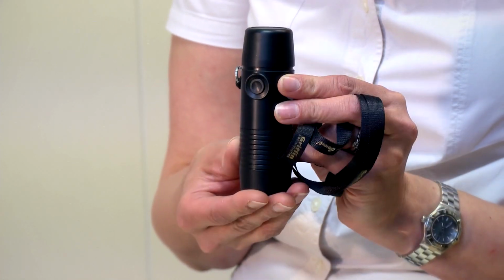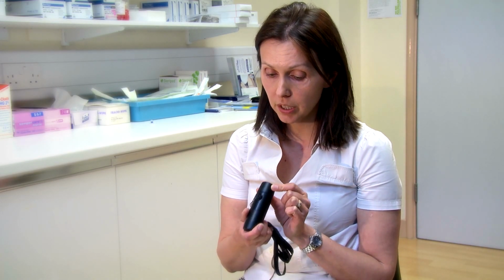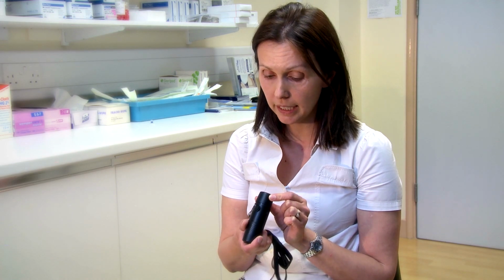This is another option that laryngectomy patients can use. It's an artificial larynx, and it's for those patients that are unable to have surgical voice restoration because surgery has been quite difficult or complicated. And it works by pressing it onto the side of the neck, and when you press the button, it vibrates to give an artificial speech.